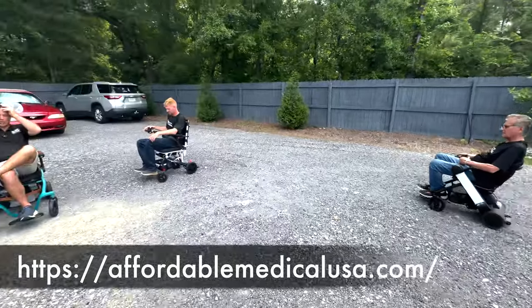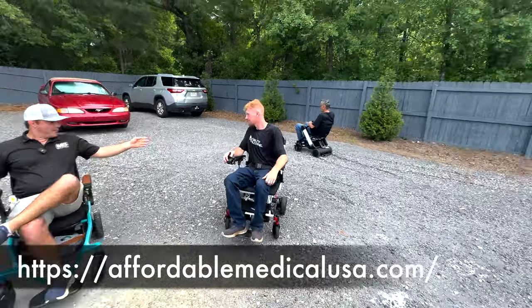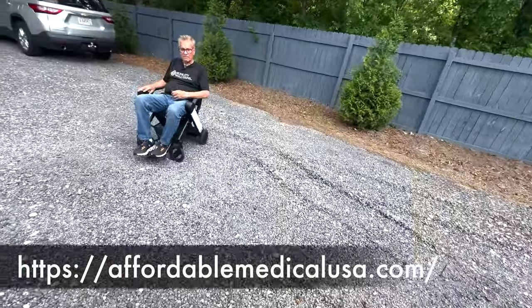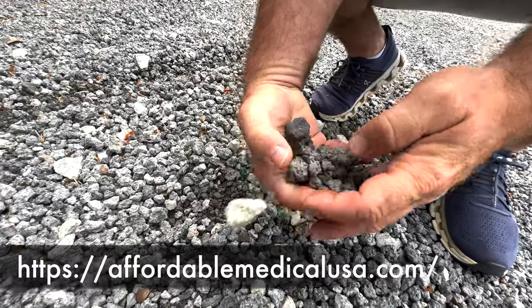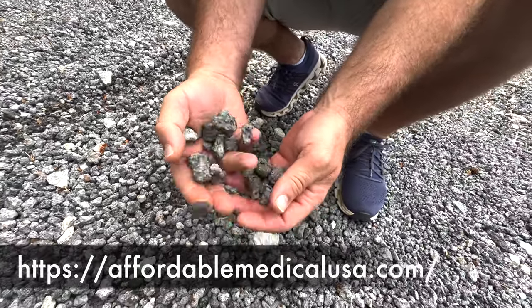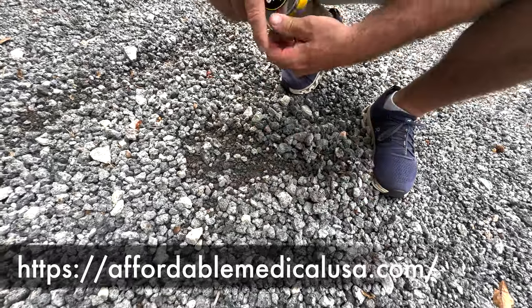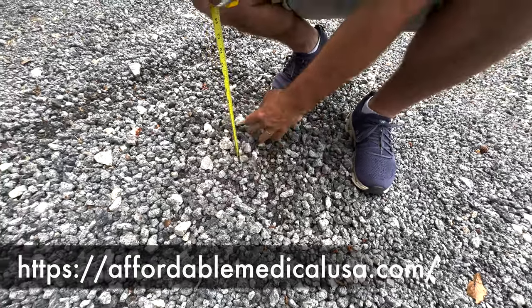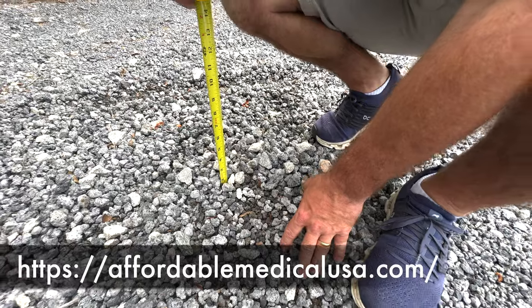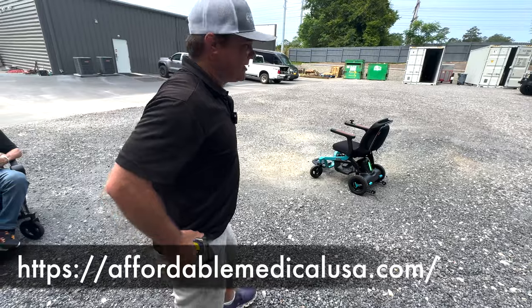If you have a gravel road, or if you go to car shows, you're gonna go through gravel. See, over there, it's real thick. You can tell where this is thinned out because of the trucks, but look how thick this is. This is called steel slag. It's heavy, and it doesn't let the water run it off. But look how thick that is. You can't expect a power chair to make it through some of these spots. Some of it's even thicker than this. I got 4 truckloads, maybe 5 back here. Actually, 6.